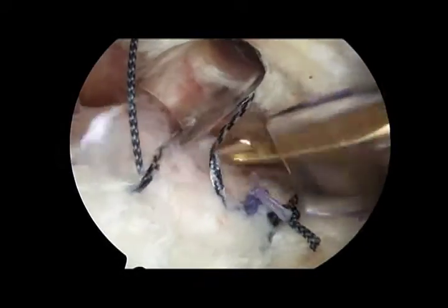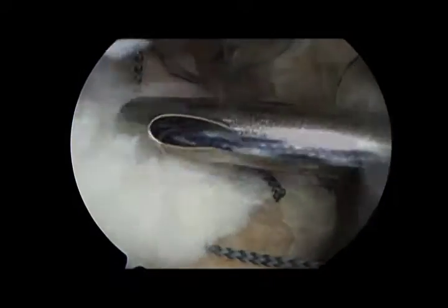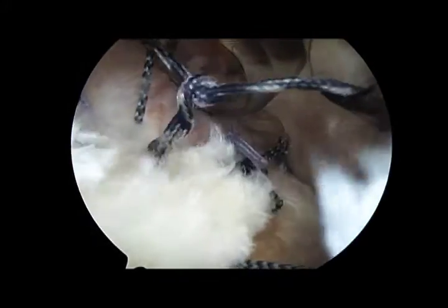Both limbs of the horizontal mattress posterior suture from the anterior anchor are retrieved and tied. Care is taken to place the knot posteriorly, such that when the anterior suture from the posterior anchor is tied over top of this, that knot will be anterior to this one, providing further suture interference.